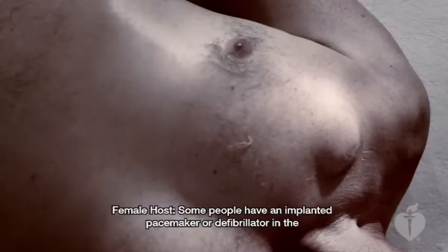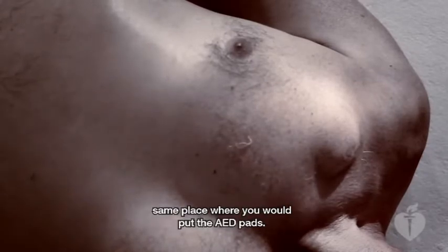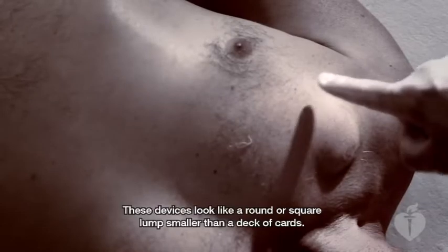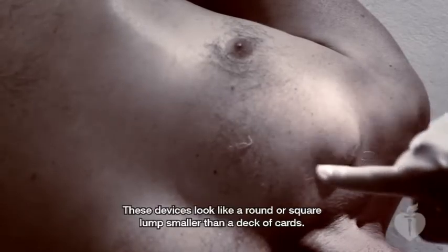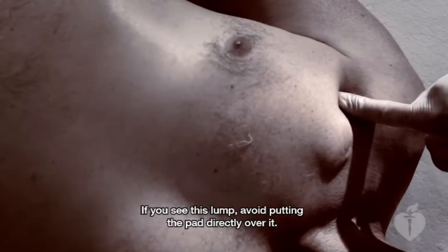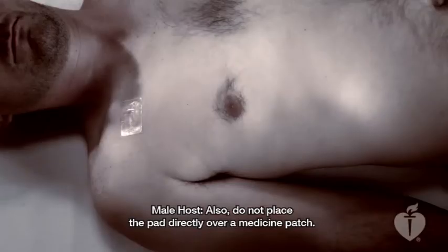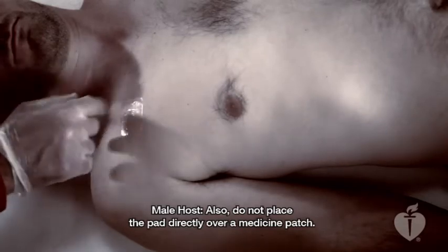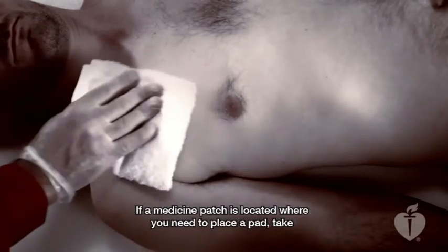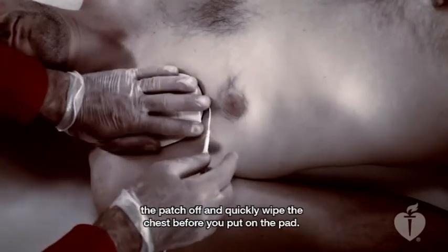Some people have an implanted pacemaker or defibrillator in the same place where you would put the AED pads. These devices look like a round or square lump, smaller than a deck of cards. If you see this lump, avoid putting the pad directly over it. Also, do not place the pad directly over a medicine patch. If a medicine patch is located where you need to place a pad, take the patch off and quickly wipe the chest before you put on the pad.